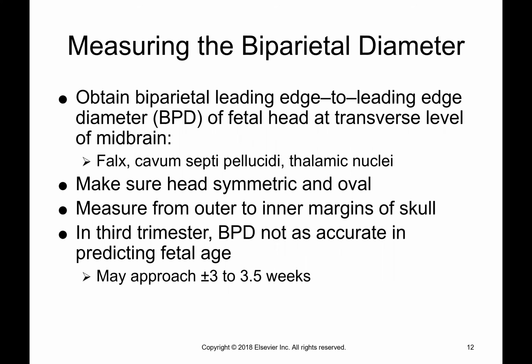Okay, so let's talk about our measurements for second and third trimester. When we are measuring a baby, let's say 16 weeks and above, actually 14 weeks and above, we don't do the crown rump length anymore. We actually do 4 measurements, and then the machine calculates it with its awesome algorithm and spits out a date for us. And then we can see how the baby is growing.